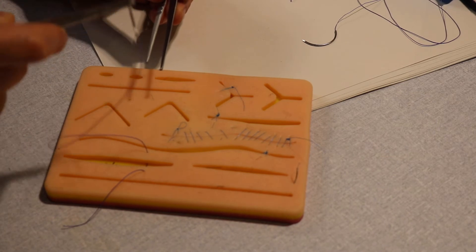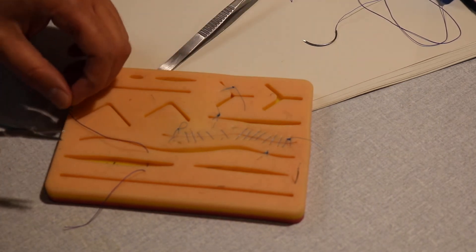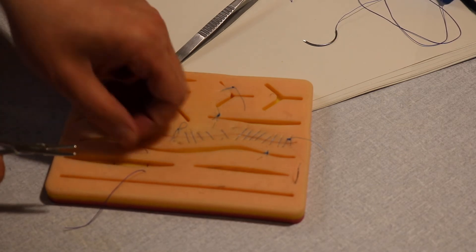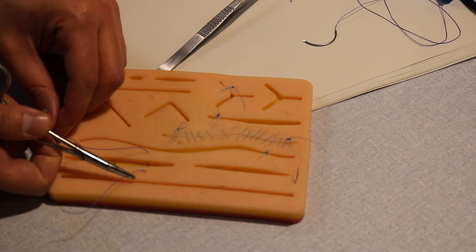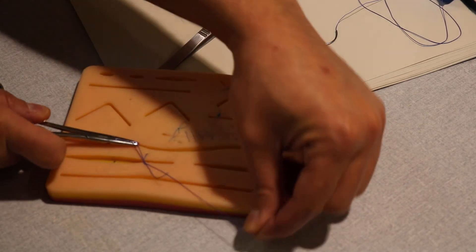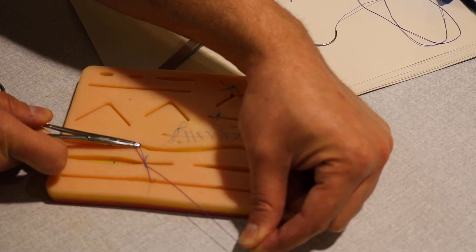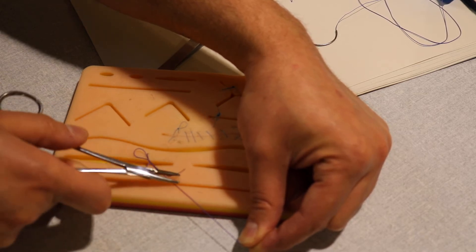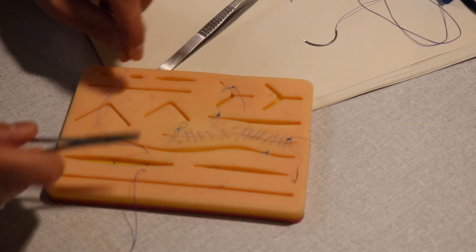So one of the pitfalls: you need to leave the needle and leave the forceps and start your tying. One of the pitfalls is to do the first one and hold it from here, not from the tip. That's one of the pitfalls that will create what looks like a ribbon. So you need to hold the tip of the short limb. That's one of the pitfalls.